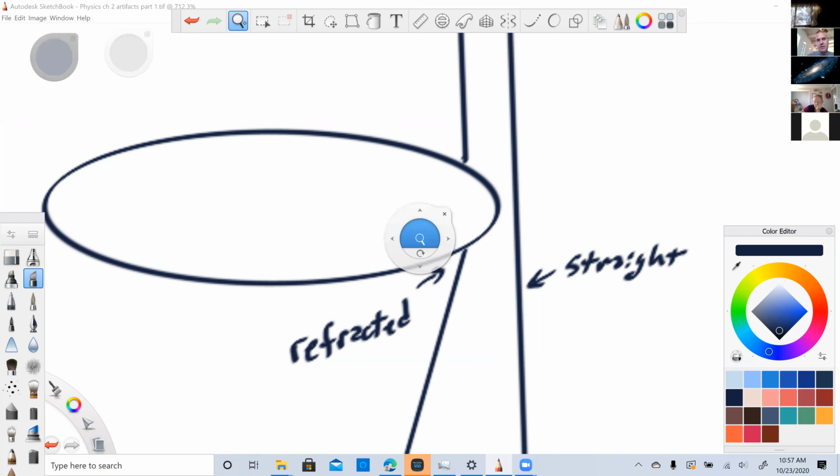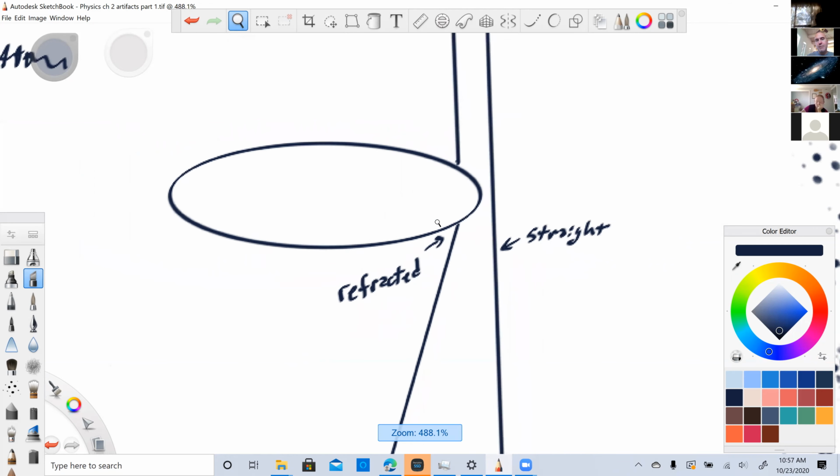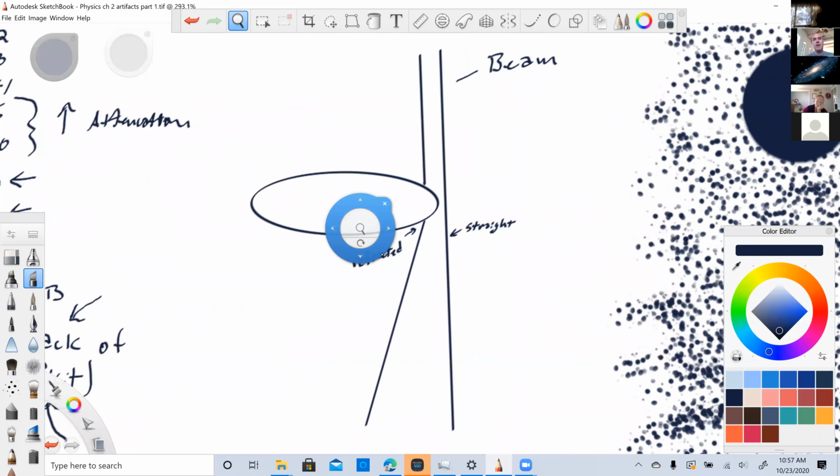So what that creates, remember, beam strength is directly related to echo strength. Beam intensity, which is strength per square centimeter, square millimeter. So it's strength over area, power over area really, and it is dependent on the beam diameter. The more narrow that beam, like at the focus, the stronger the intensity.